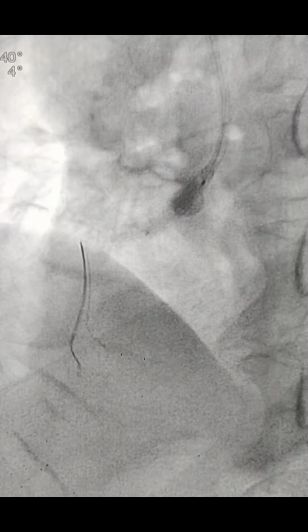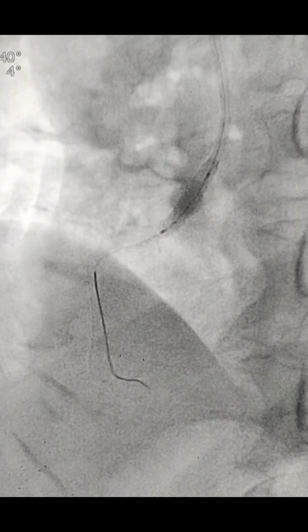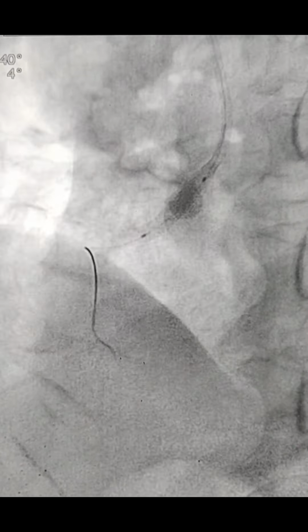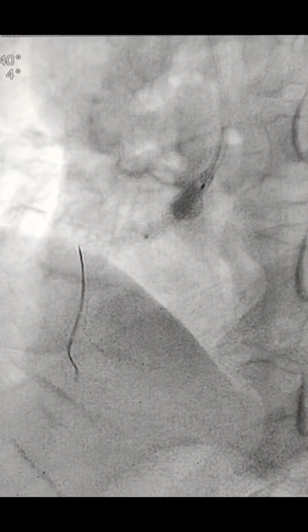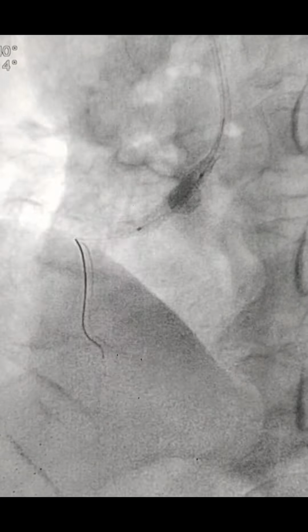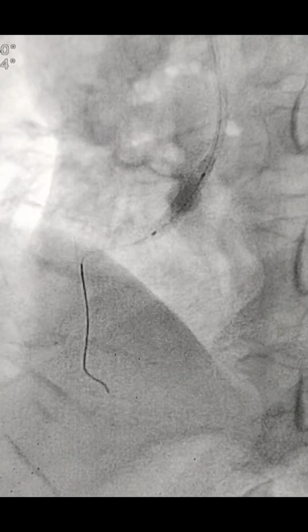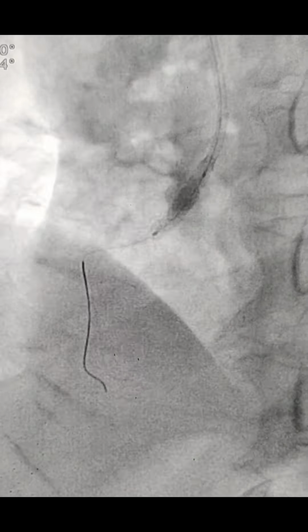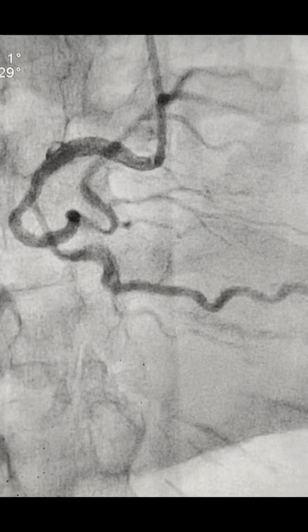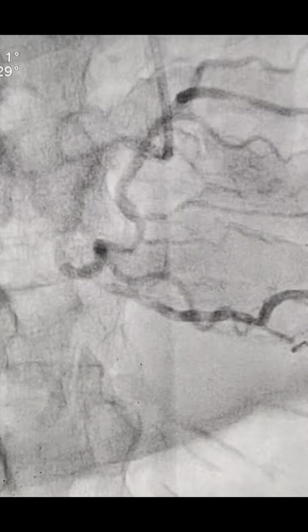And we flared it off with the same balloon because as a standard we should have a different balloon, a special balloon for the ostial lesion, which has a larger diameter outside the RCA and the same diameter inside the RCA, but we didn't have that, so we flared it with this balloon. And after flaring of this balloon for this ostial lesion, this is the after stent shot, and you can see the RCA. So this was the angioplasty to LAD and RCA in this NSTEMI patient.